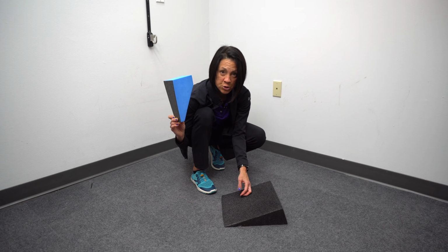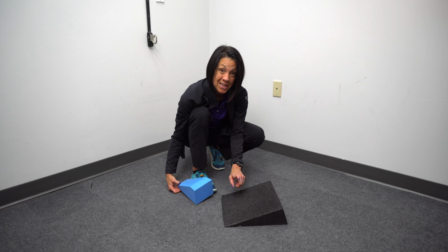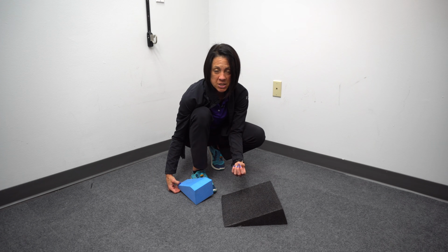Okay, so if you want to learn joint mobs, watch the video for this one, but now let's go ahead and dive into all the ways that you can use this wedge to prepare your body for walking without that spasticity potentially being as severe when you try and get up and stand and walk.